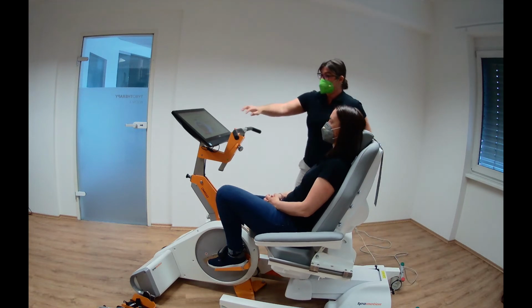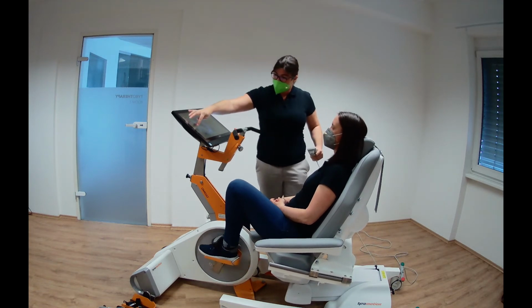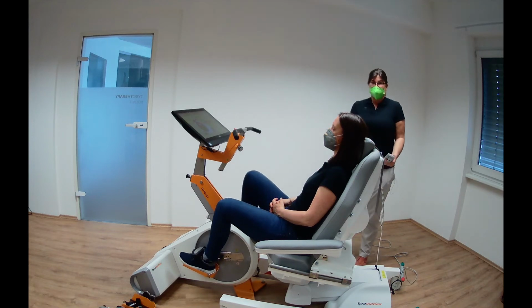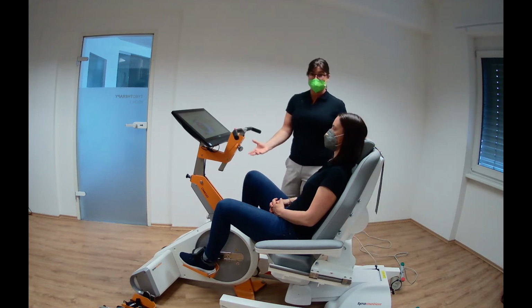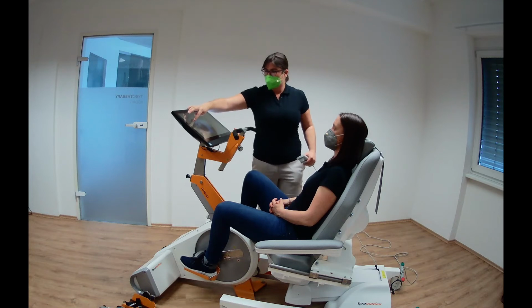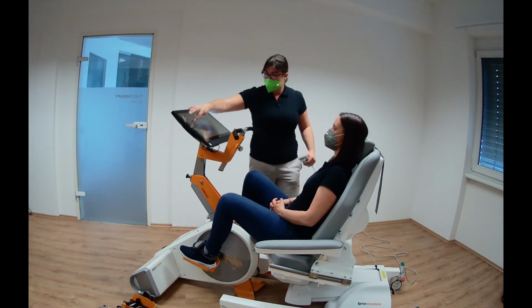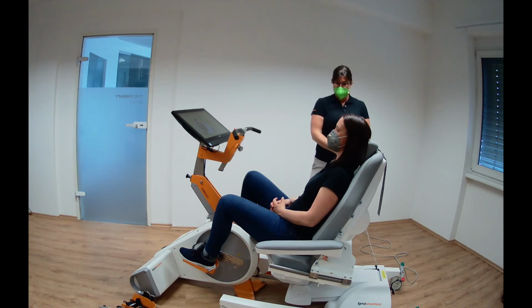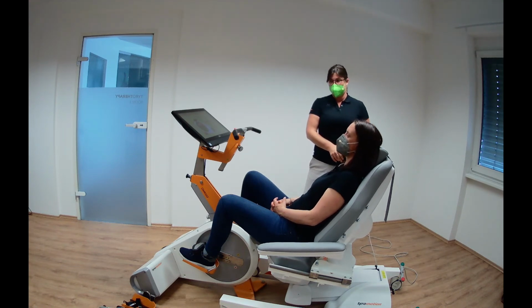And if we are in an almost lying position, we need another group of muscles to stretch the legs forwards or backwards, or to perform this movement. And for that, we can stay in this position, but of course we can still bring her in a more lying position.